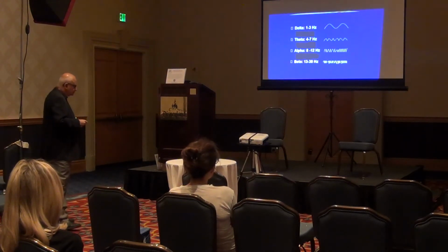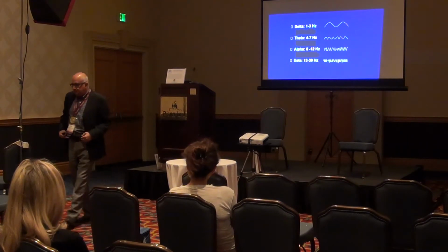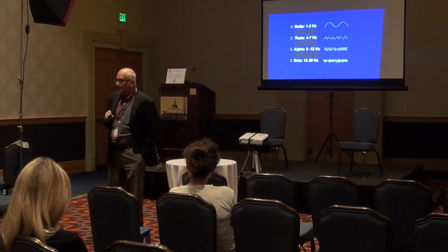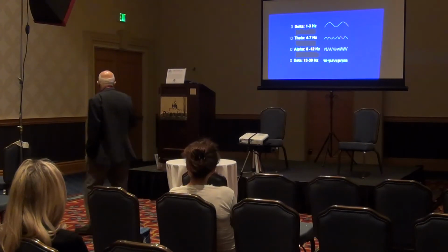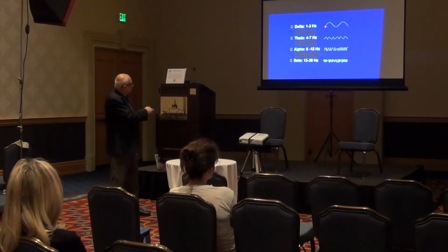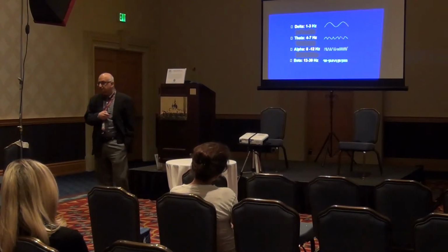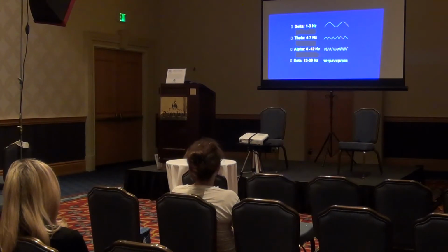So, the other term people use when describing the EEG, this is important. We sometimes say, oh, he's got some generalized slowing. So what do we mean by that, right? We describe the waves in these different bands. This is called a delta wave. Looks kind of like that. That is usually 1 to 3 hertz, hertz being cycles per second.